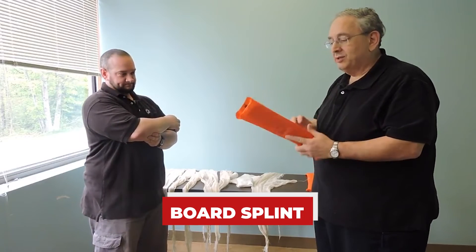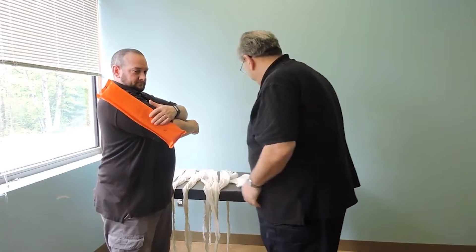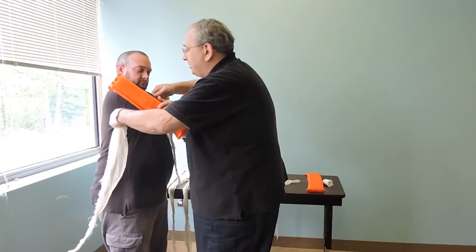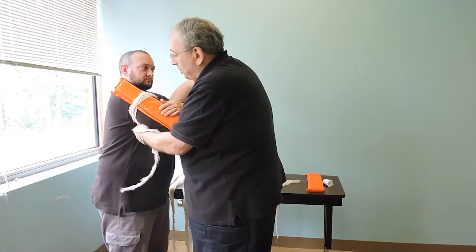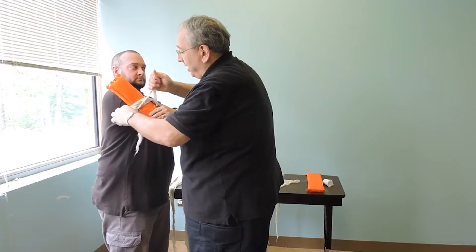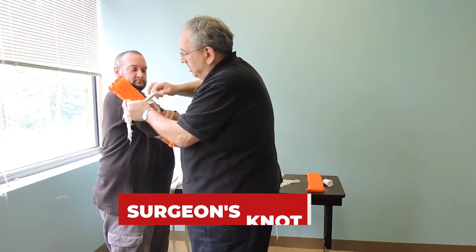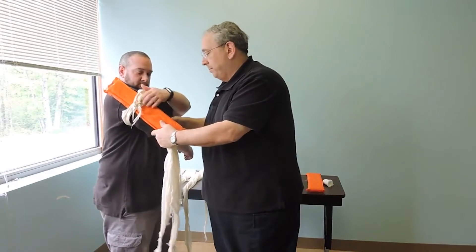I'm going to use the board again — the two sides, padded side against the outside of the humerus. I'm going to try to get my partner to hold this as I'm tying it. I'll need two cravats this time, and the first one is going to go way up in the armpit, holding this board up high so that I don't impinge on the injury. We tie it against the board side because we don't want to compress the patient's skin. Again, that surgeon's knot.